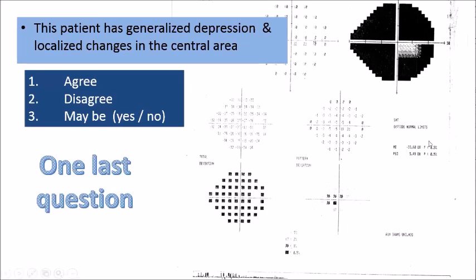Now, I guess this could be my last one for the polling. In this field, this patient has a generalized depression and localized depression in the central area. Agree? Disagree? Maybe.